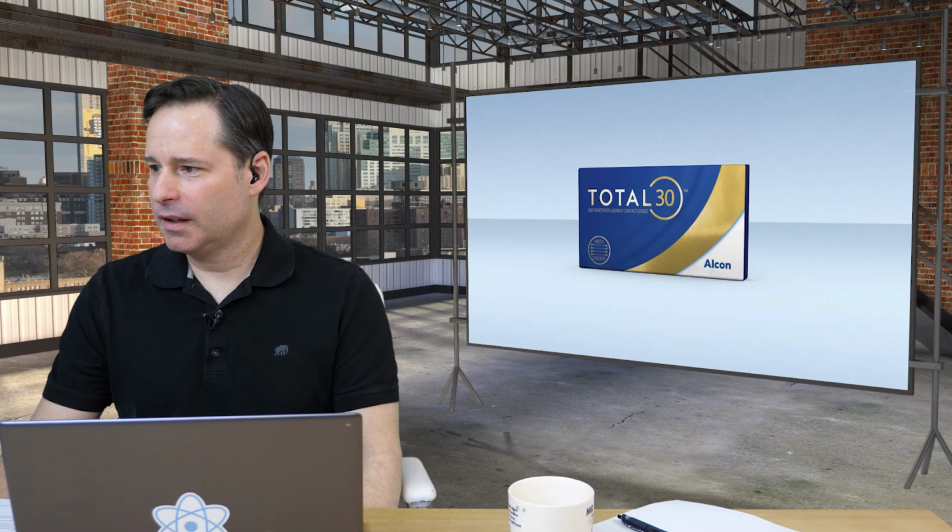Right. And Jessica, why do you think that so many people are still using reusable lenses in 2022? Sure, it's a great question. What I see in my practice are patients who want to be in these monthly replacement lenses for a whole variety of reasons. The first one that comes to mind is always cost, but cost isn't just the only factor. We'll have patients that are interested for other reasons, and also the easy to remember replacement schedule. It's very easy to remember when you change your calendar or when your phone kind of clicks into the next month, that's the opportunity for you to switch out your lenses.